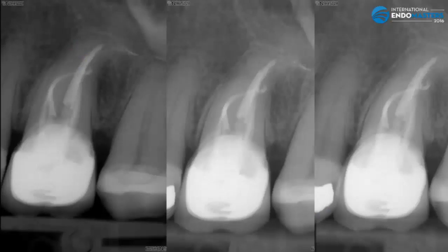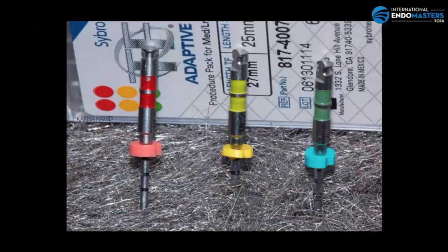After seeing the final obturation, I realized that the file worked great, because there weren't any separated instruments inside the canals of this very complicated case. As you can see, these files have two colored rings that indicate they are the ML sequence.